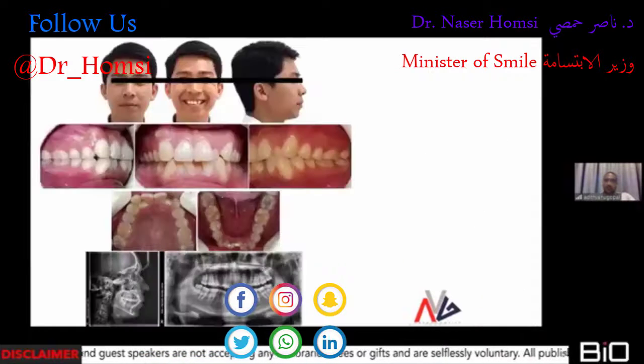Now, with this confidence, I moved on to this case. Now, everybody has probably seen this case as well, so I'm just going to rush through it. I thought I'm going to be able to gain the same amount of space. Looking at those excellent cases on social media, I tried to replicate the same with these cases. And I thought that, yeah, I've seen people opening up spaces out of nothing. So I would be easily able to open up these spaces using open coil springs, which I tried.